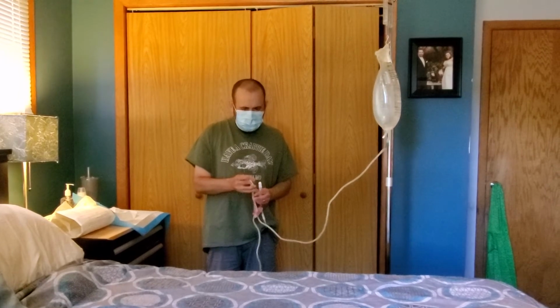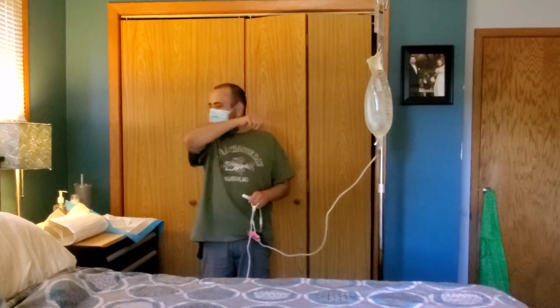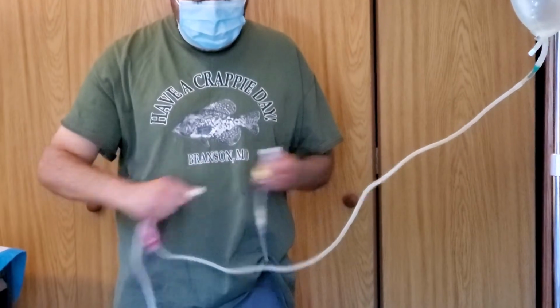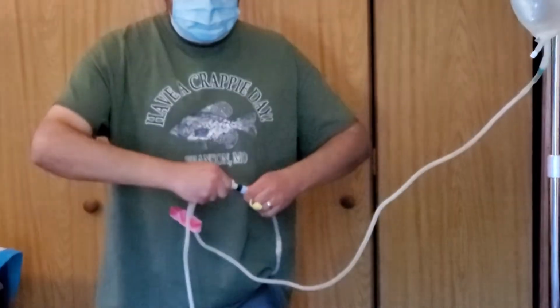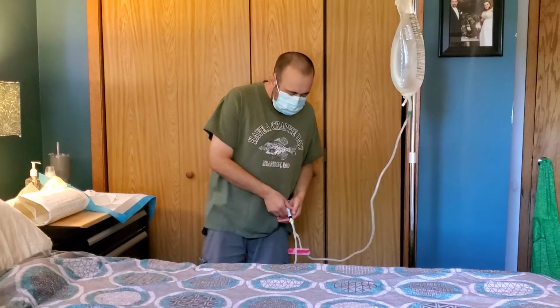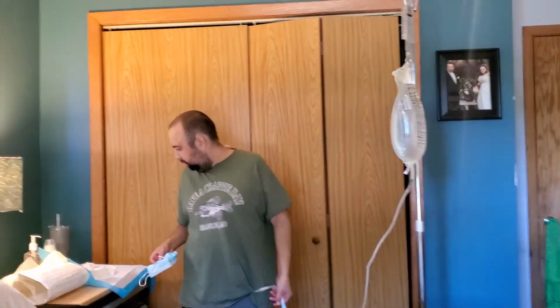So this is the most important part about being sterile and being clean, because once that cap comes off, it has a direct line into his body. Yep. So I'm gonna loosen this one first, then pull that off and connect it. And those are garbage. And at this point we can take our mask off, because I'm already connected.